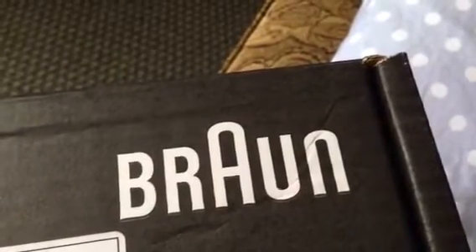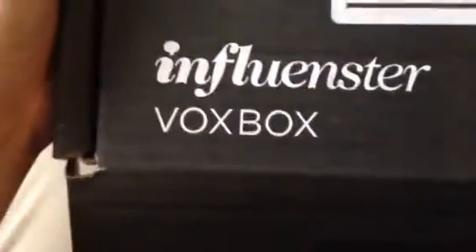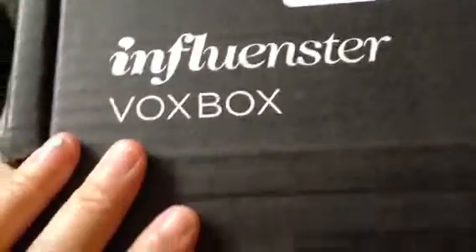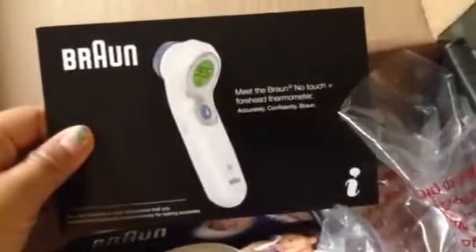Hi everyone, I just want to do a quick haul video and a demo for an influencer box I received. I just received this today in the mail — this is the forehead thermometer.